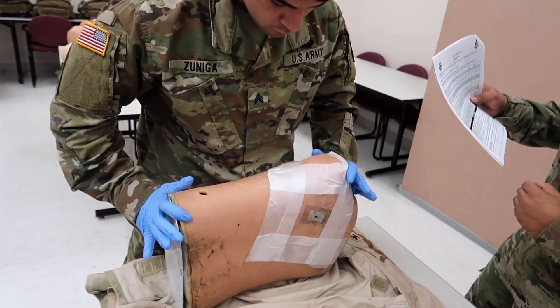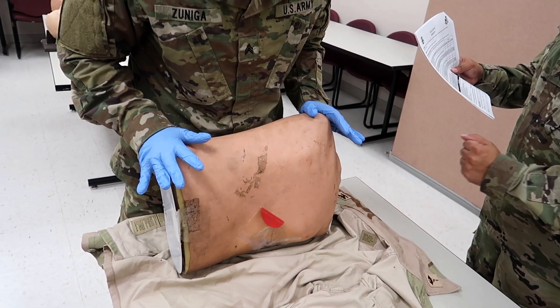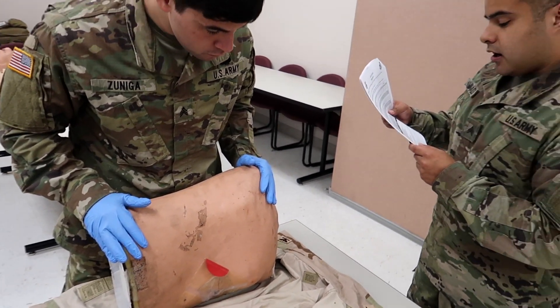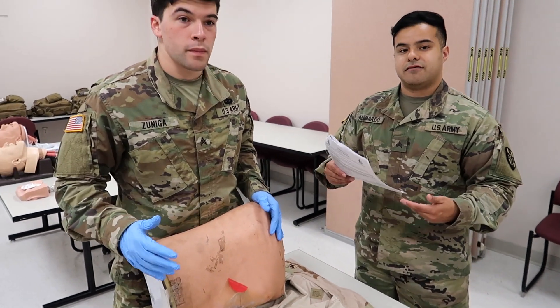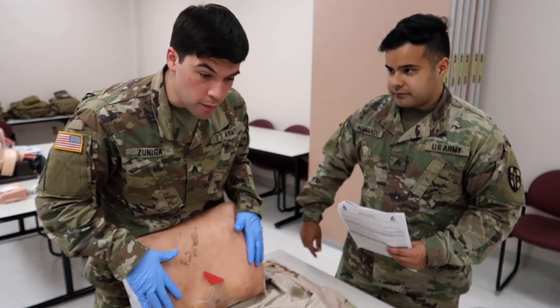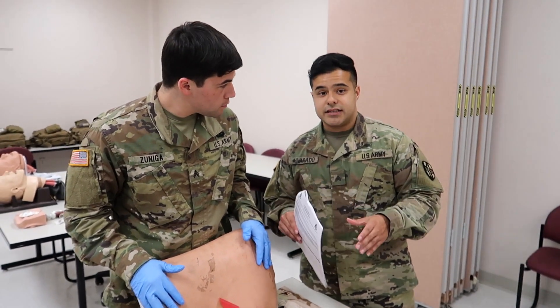Now he's going to place the casualty in the sitting position or injured side down in the recovery position. He then verbalizes continued assessment of the casualty for signs of progressive respiratory distress and continues to monitor the casualty for aggressive respiratory distress. That concludes this procedure.